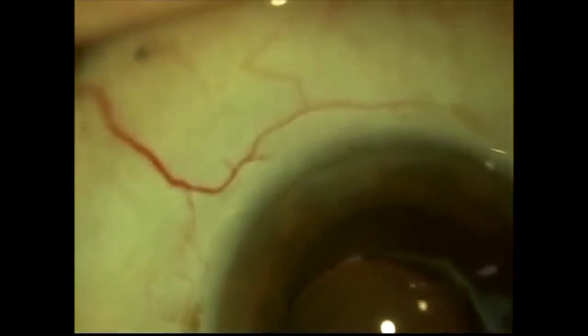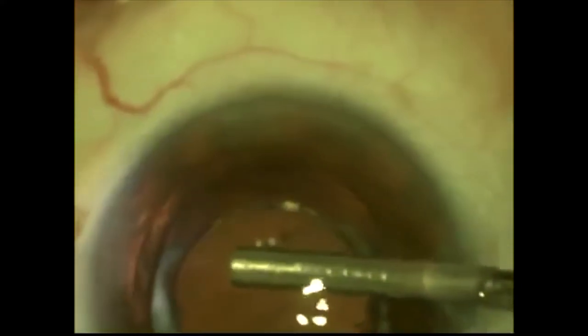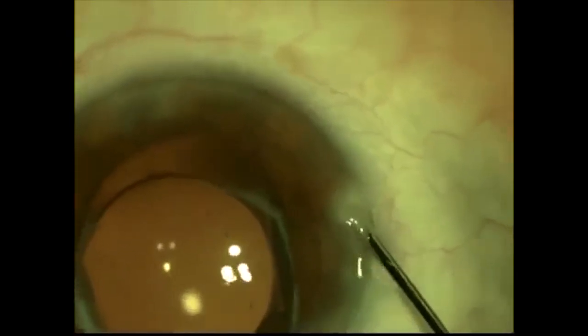This was quite extraordinary because there was really a minimal amount of vitreous coming forward. Now we're looking at both sides again with our endoscope to see where vitreous might be present. Once we've determined that vitreous is coming around the edge of the lens and verified that the lens is in the sulcus, we replace our chamber maintainer, introduce a vitrector, and remove all traces of vitreous using the Sipser luminary light on the right — a shielded luminary probe made by Escalon Trek, designed for anterior segment work. Then we hydrate the wounds and do the betadine test, which assures us that there is closure of every wound and they're watertight.